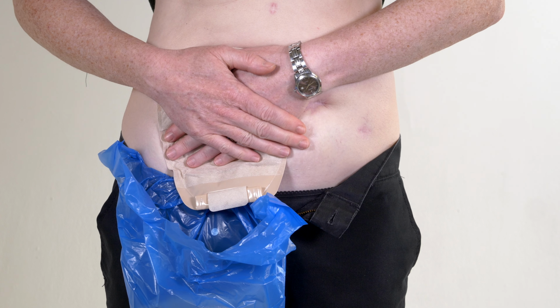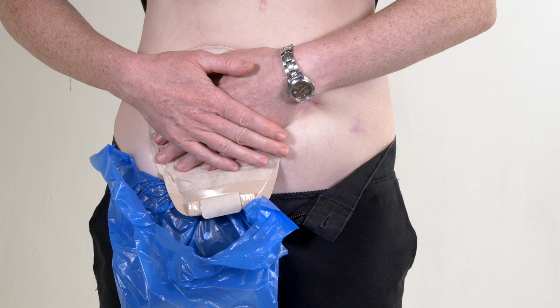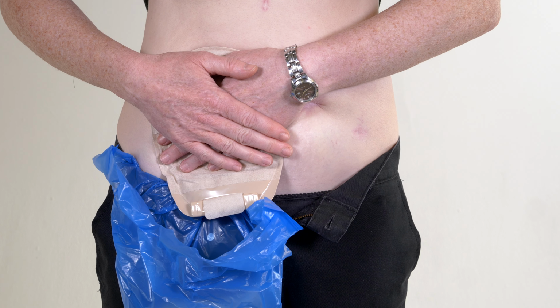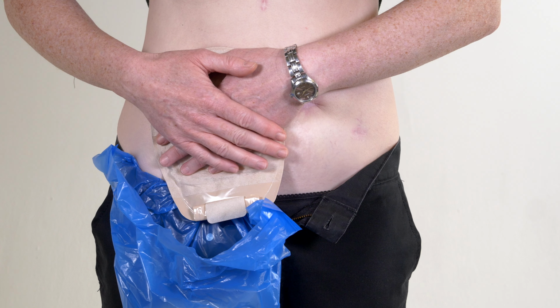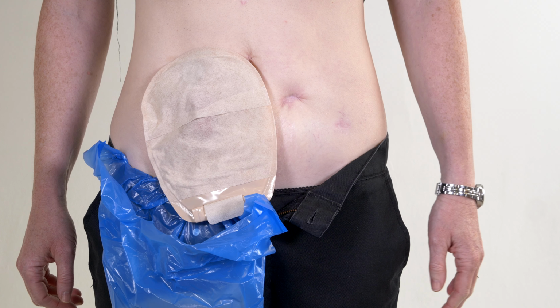Once the pouch is in position, hold it in place with your hand for 30 seconds to a minute. The warmth of your hand helps the adhesive stick more effectively to your skin. And that's it, your new pouch is securely in place and you're ready to go. Regular careful changes like this help keep your skin healthy and your stoma well managed.